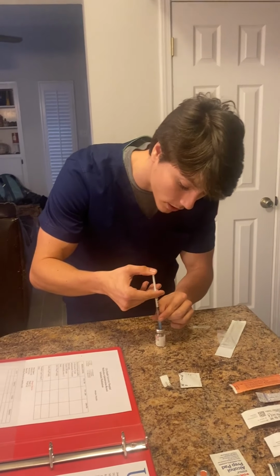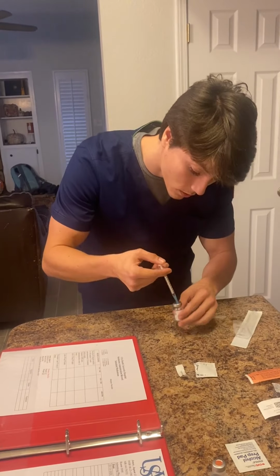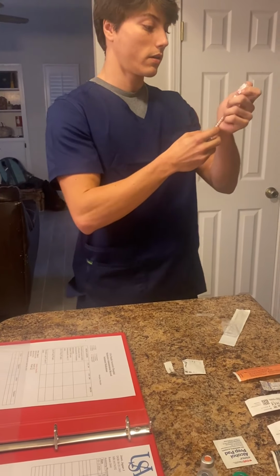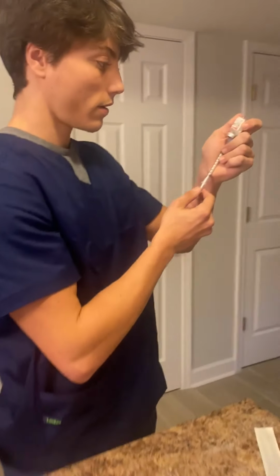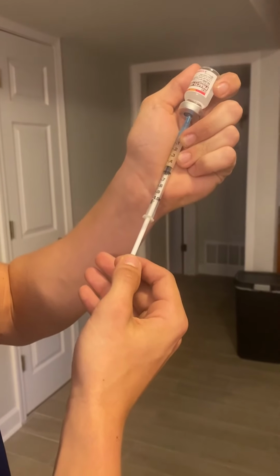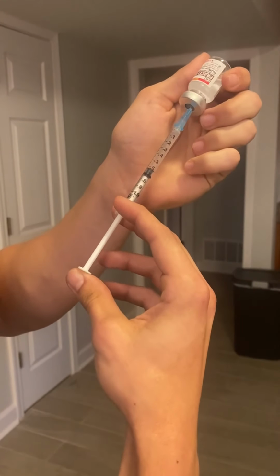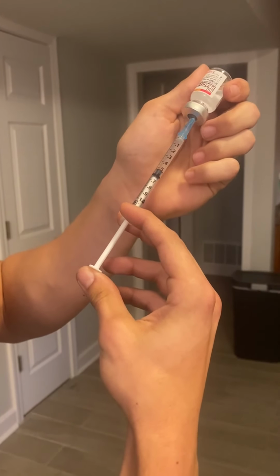And now we're going to inject that in. Now we're going to flip it upside down and come over here. And I'm going to draw out a little bit more than 0.5 milliliters, just so I can make sure that there's no air bubbles.